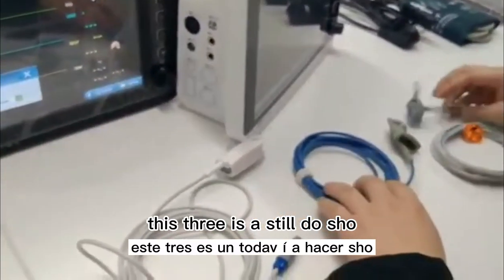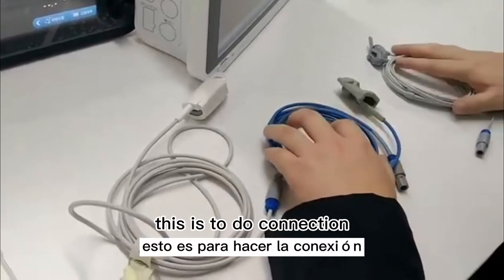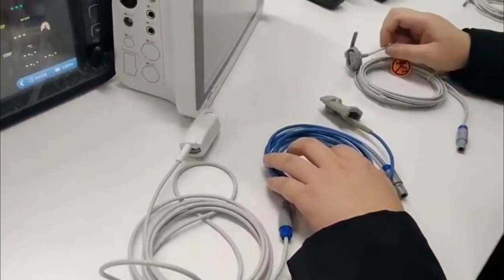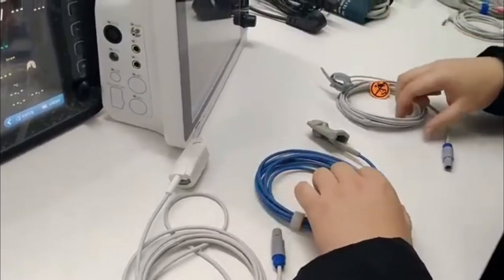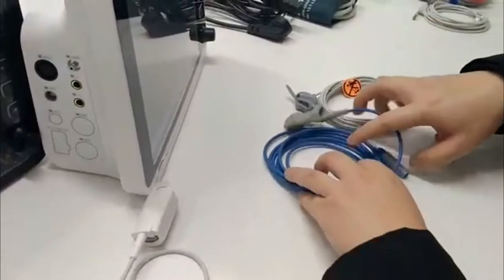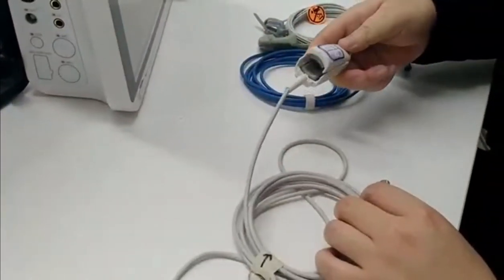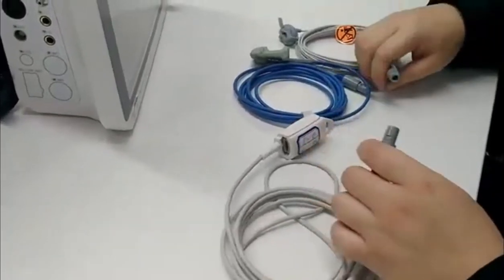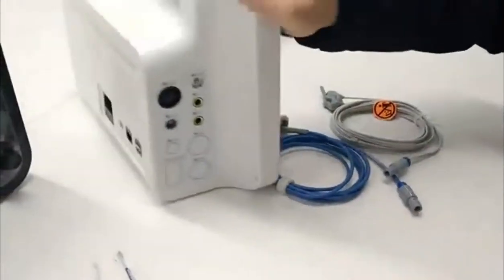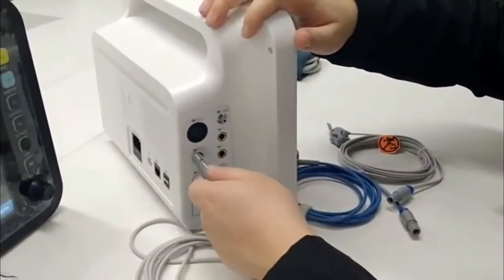These three are SPO2 probes. This one is normally for neonates, for newborn babies — it is a drop-type SPO2 probe. This one is for adults, normally — adult SPO2 probe. The connector is all the same. This is the SPO2 connector.